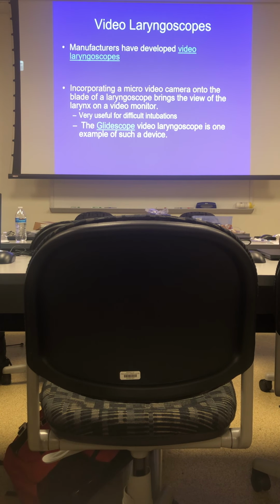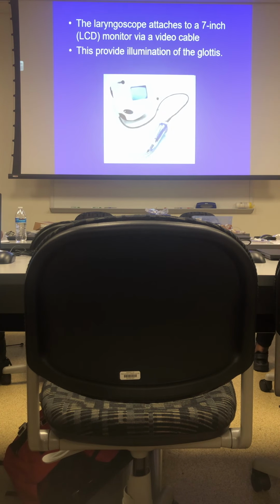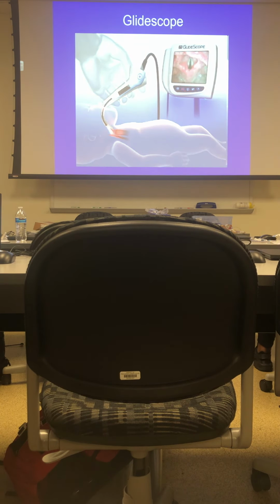We have a GlideScope, which is really, really cool. So this device here is new over the last few years, and it's lit up and it's connected to this video. There's a video camera at the tip, so you can see exactly where you are because of this camera, and you can look at the screen when you're intubating. How cool is that, right?